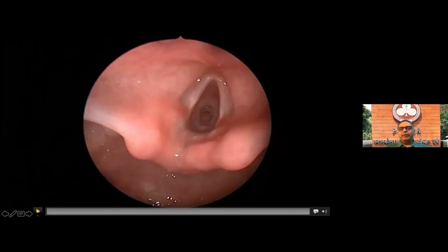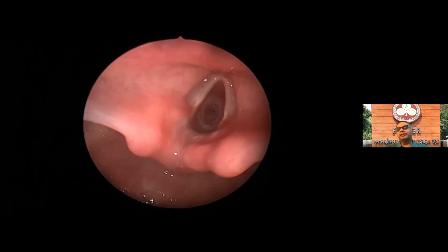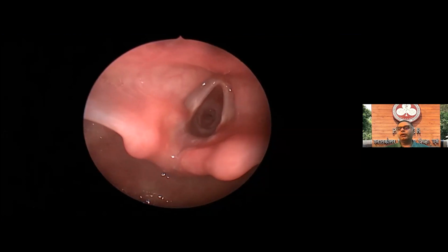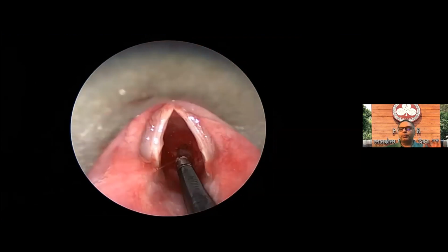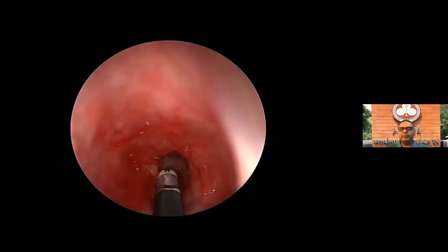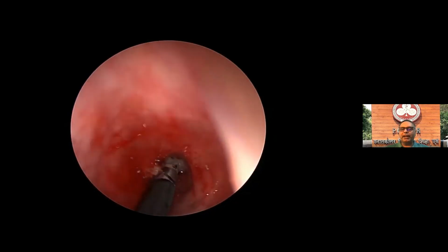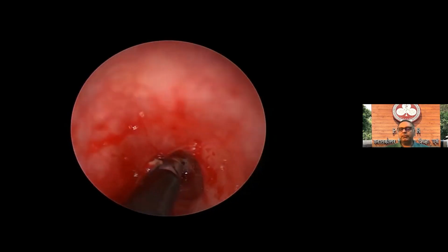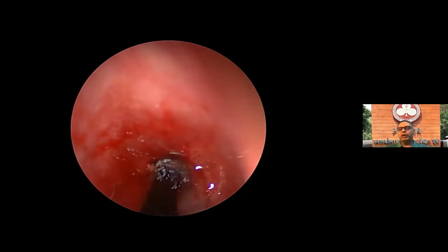This is a child, and we are using a microlaryngeal wand, which is the sharp wand with a single electrode. Again, in this case, since it was taking us longer, we had a suspension laryngoscope, as you can see. So the endoscope is threaded along with it. And this is a microlaryngeal wand, which has a 2.8 millimeter diameter. And we gently open up the stenosis.